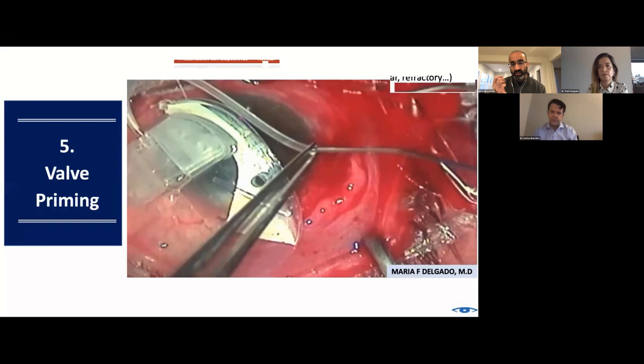similar to what you just showed in the video. Nate, what's your experience with that? I think you're the number one Ahmed user in the world these days. So, I mean, you do a ton of these. So what's your take on the priming part? Yeah, actually one interesting thing is I'll have my technicians prime in some cases, and they seem to get it done.